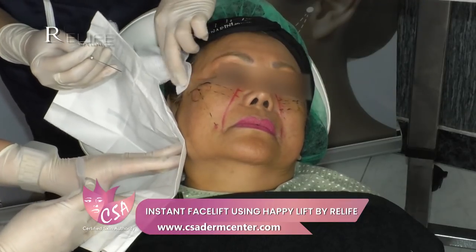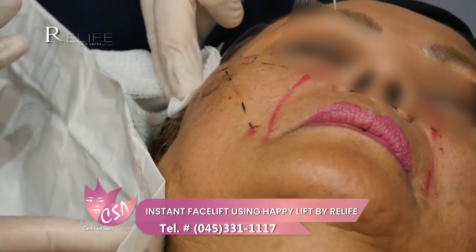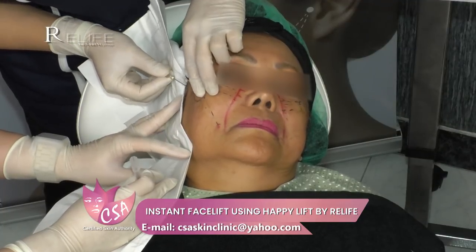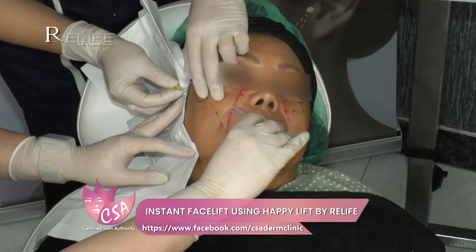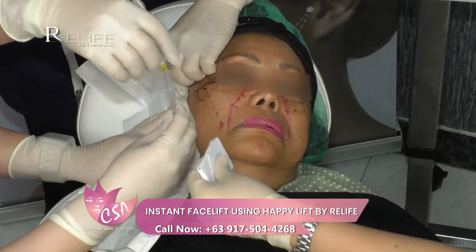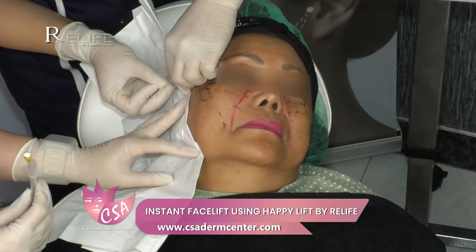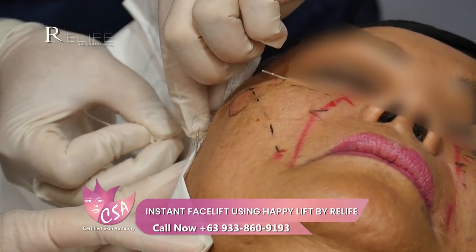The next reshaping line will be one centimeter lateral to the first entry point, near the hairline region. I made an entry point here, one centimeter below the first reshaping line, following the path to the target area to my exit point. My second free-floating thread is again made of caprolactone lactate — it's an absorbable suture suspension thread, barbed, bidirectional, convergent type.